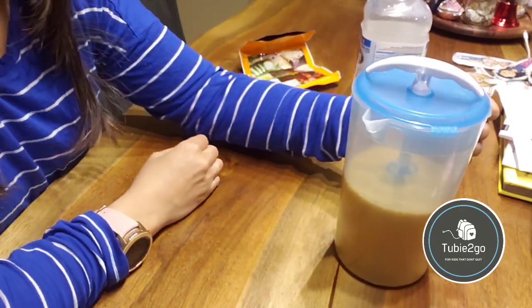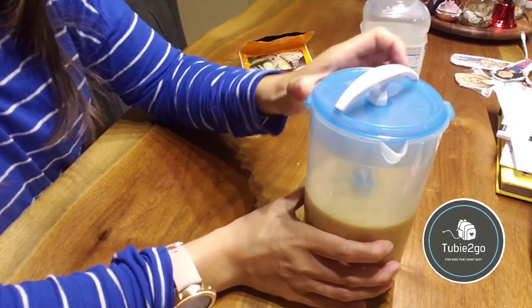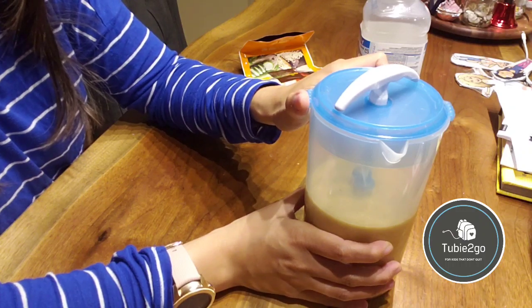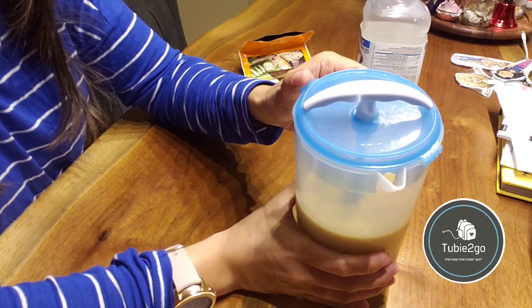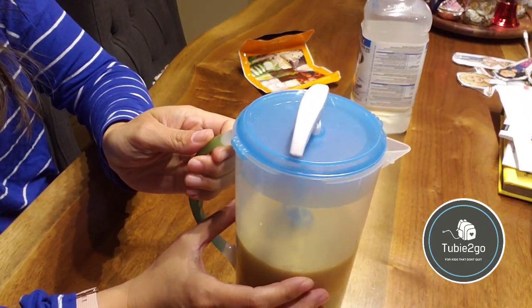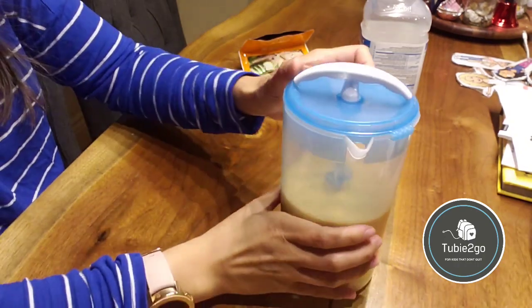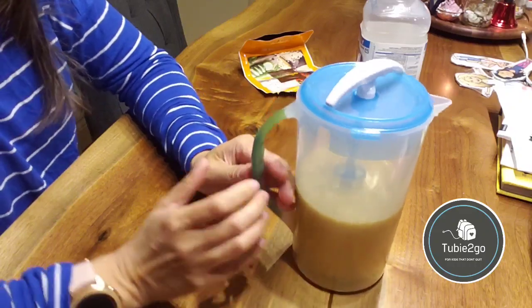When I'm ready to pour it into his bottle to warm up for his next tube feed, I would just take it out of the fridge, twist the lid open, and pour it out. It's got a very sharp spout so there are no worries about spillage into the bottle.